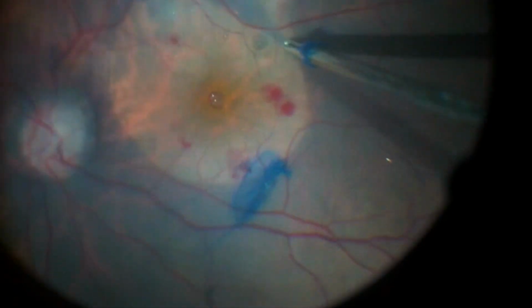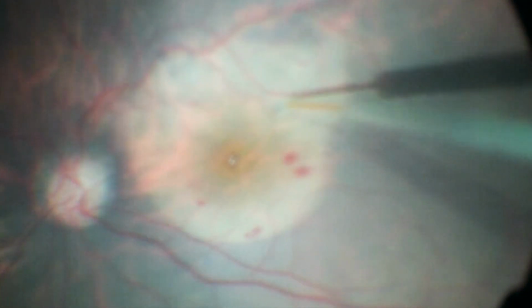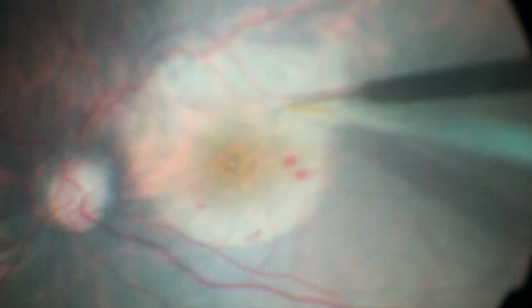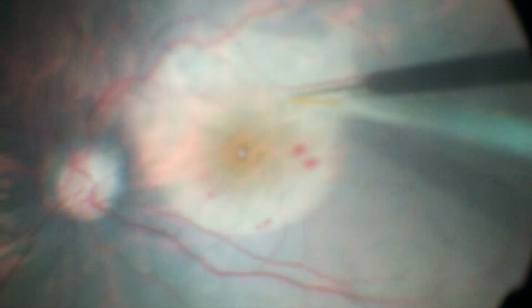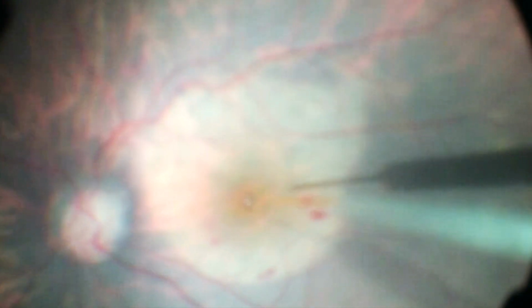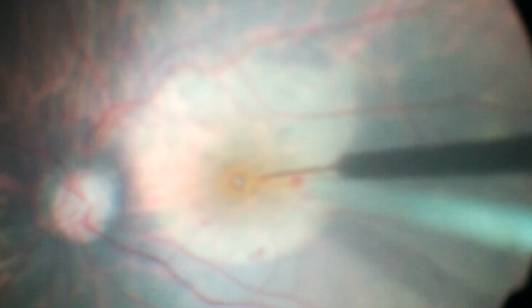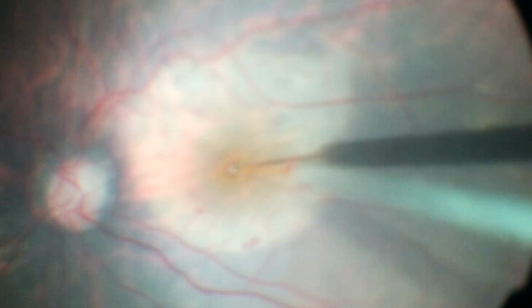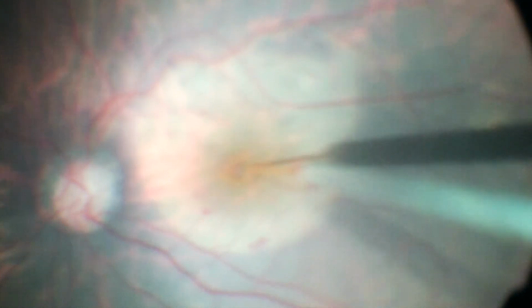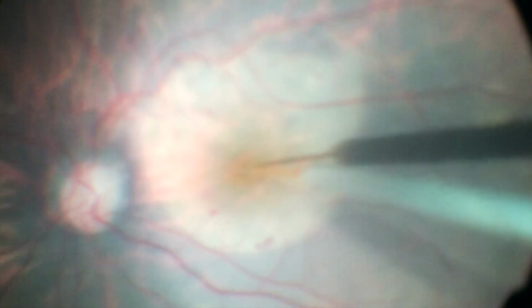Using a 38-gauge cannula, the surgeon gently touches the retina above the bubble located temporally to the fovea and performs active aspiration. Then, she carefully repeats the step in the foveal region, successfully aspirating the bubble through active aspiration. A smooth touch of the cannula in the bubble area, and a low vacuum setting for the aspiration, were sufficient to effectively aspirate the residual perfluorocarbon.